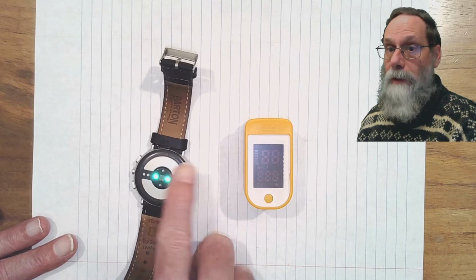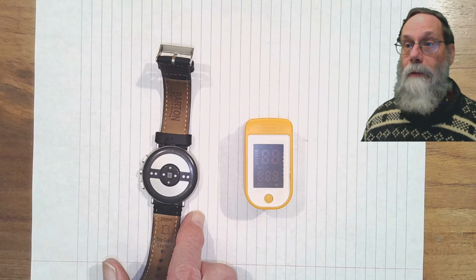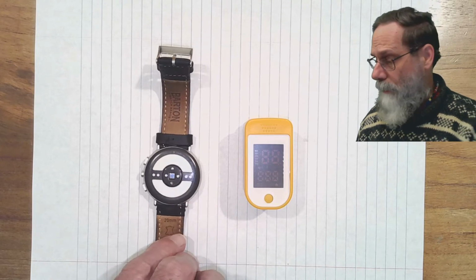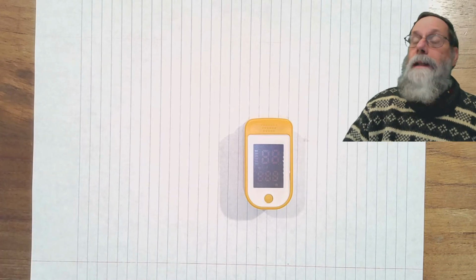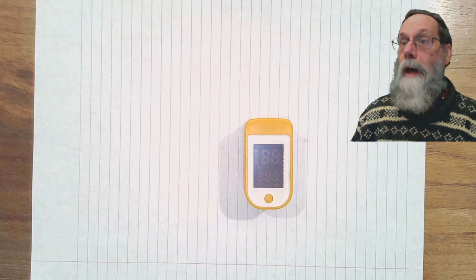And that pulse monitor has green LEDs that are flashing on and off there, which you may not be able to see in the video because they may be synced with the video too much. All right, how do these two things work? And how do we choose things like what color LED do we use? All right, let's take a look at the different ways that we could monitor blood.